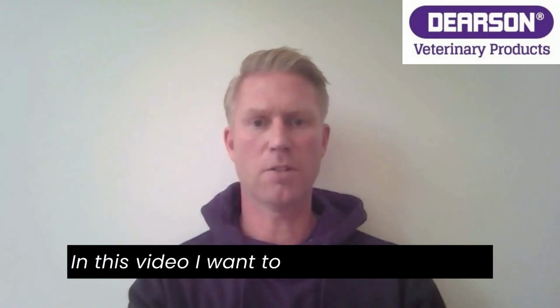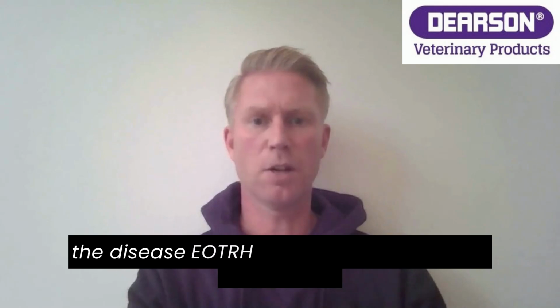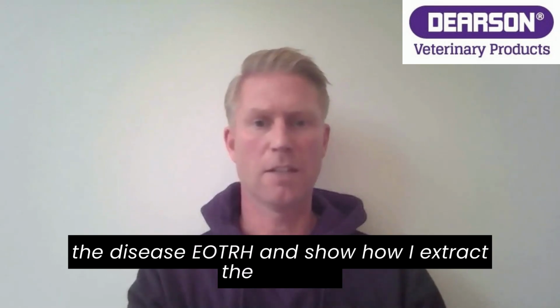In this video, I want to explain a little about the disease EOTRH and show how I extract the incisors.